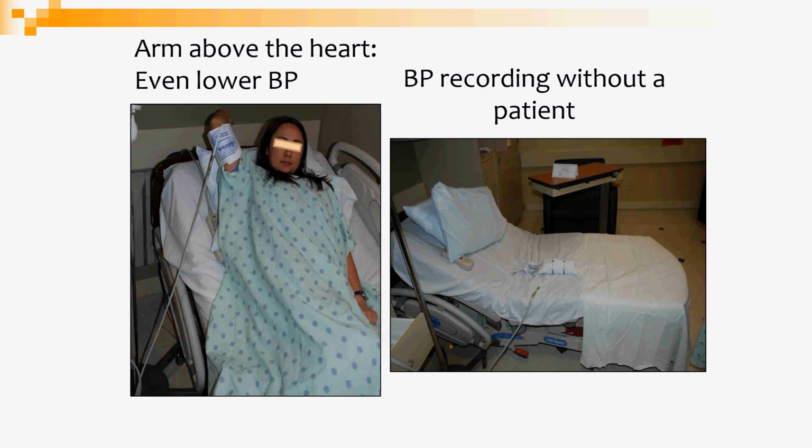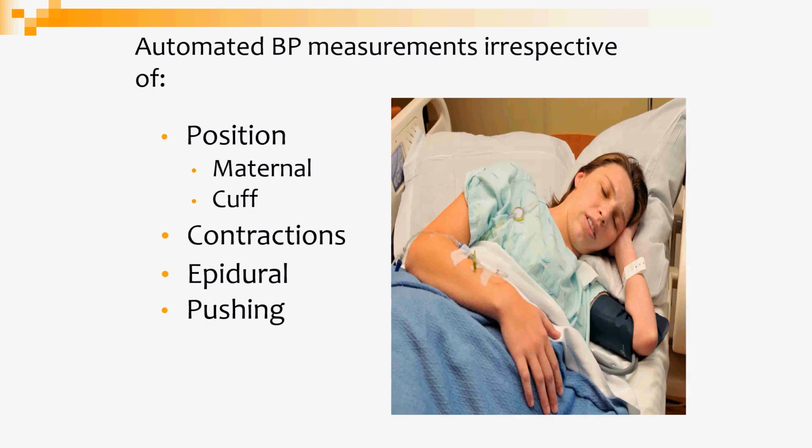If the arm is above the heart, it's going to lower the blood pressure even more. And the picture on the right, we've seen that all too often, that the cycle in the auto cycle is recording or maybe inflating without it even being on the patient. So it's important, again, as mentioned previously, that if it's on auto cycle, that we make sure that we go and check, and staff checks regularly that it is actually recording and that it's appropriately placed. Next slide.